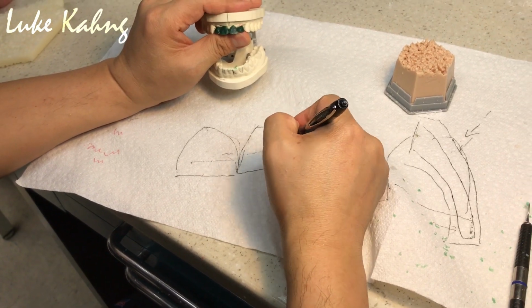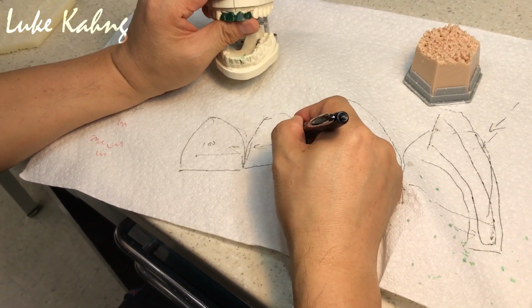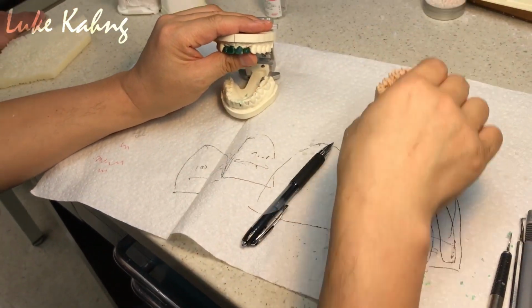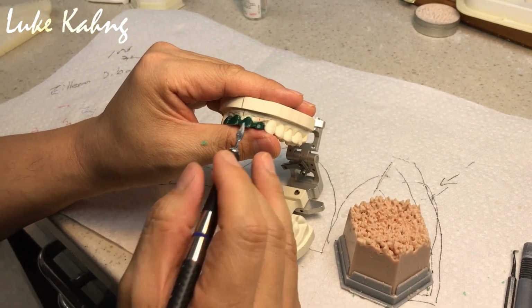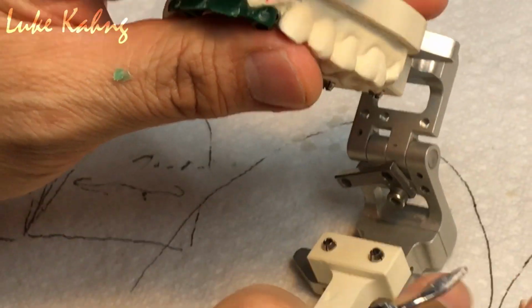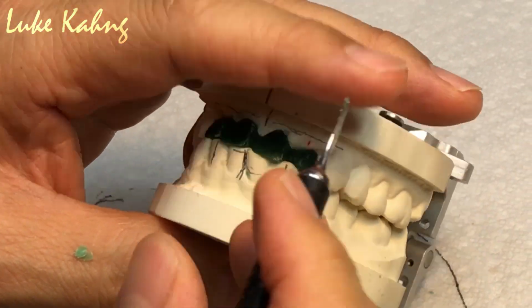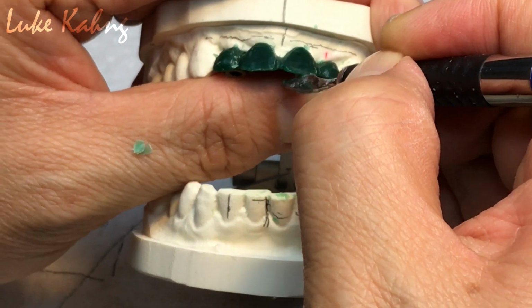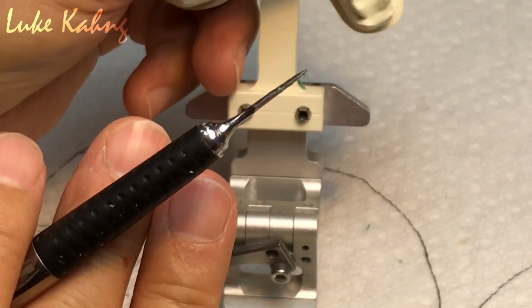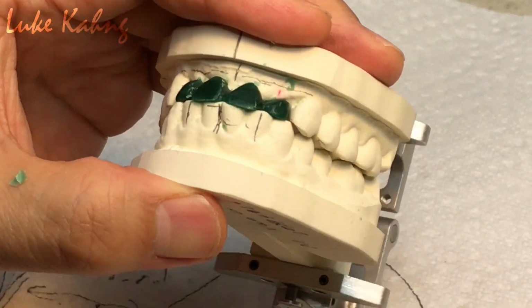So the final golden proportion is 100%. Here is 70 to 80%. So what I did here, right, I'm going to cut a little bit more here. Why? Like I said, here is my final, so I need room. Right now it's a little bit big, so I cut it in this direction. So I see movement. Okay, it's good.